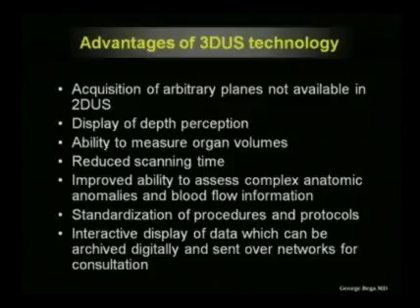But otherwise, it's clear to us that there are major advantages. We are able to get depth, we are able to get image planes that are not possible, and we can get both of these at the same time. We can better improve our assessment of complex anatomical relationships. We can standardize our procedures and protocols much better. And last but not least, this information is digital.